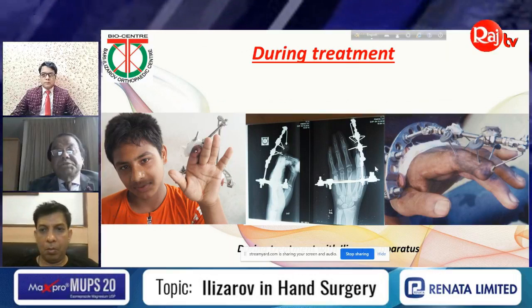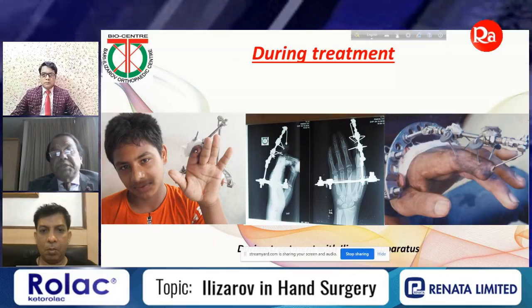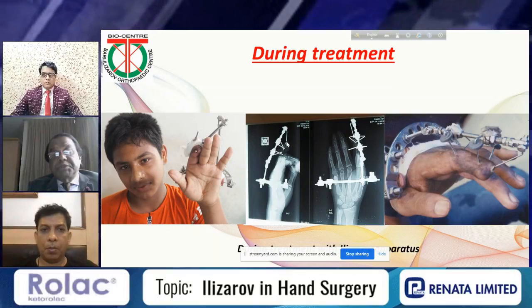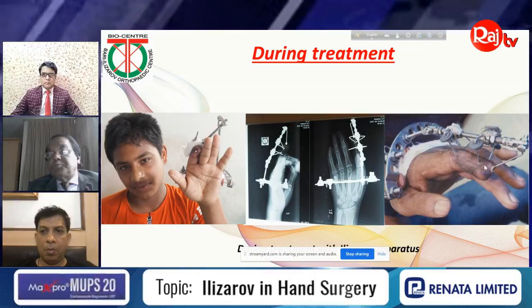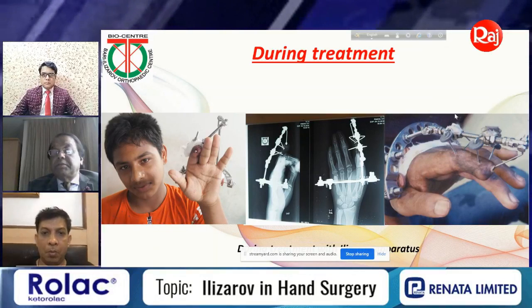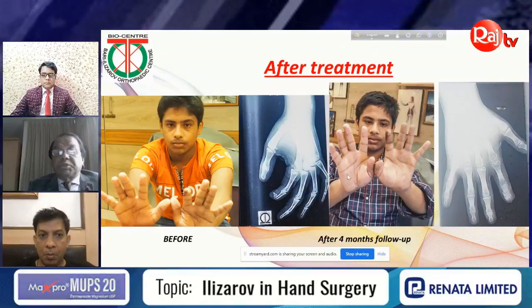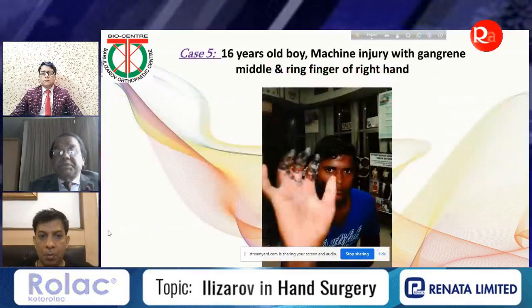What I have done, you can see here, just one bow here, mini fixator, and here the distal part was angulated. I put two wires here, two fixation and olive. Gradually, you can see here, I have just pulled this one distally, and the fixation was like that. The mini fixator, one arch, the bow, and then gradually, see, this is almost corrected, almost corrected. Before that, and this is after.